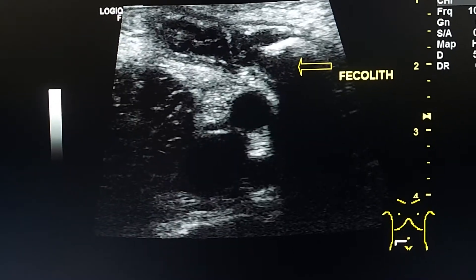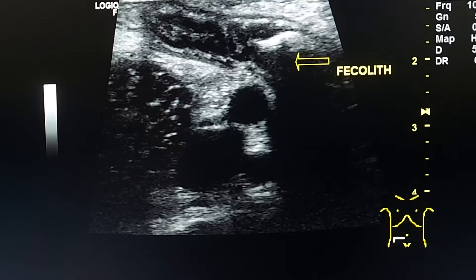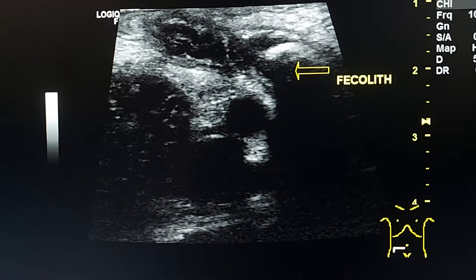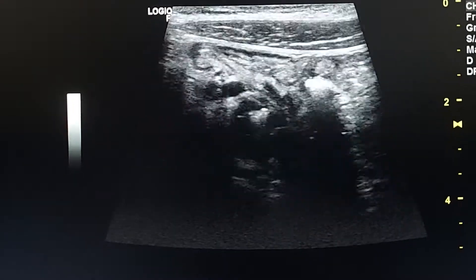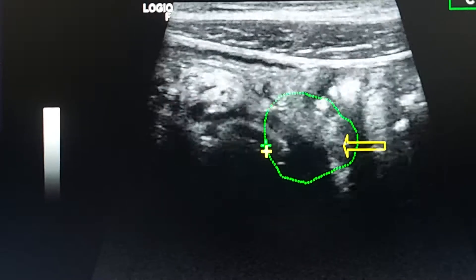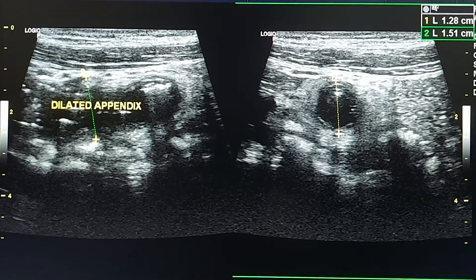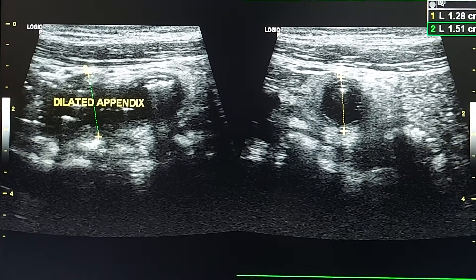The shadow is distinct. So this is a fecalith, not feces. The distal portion of the appendix is dilated — it measures 15 mm.